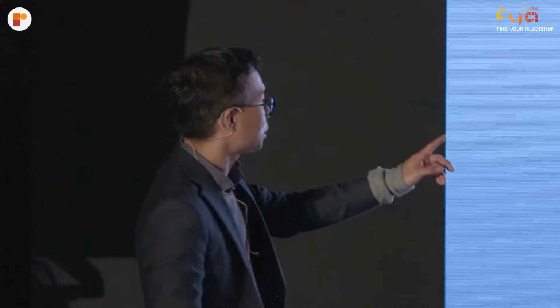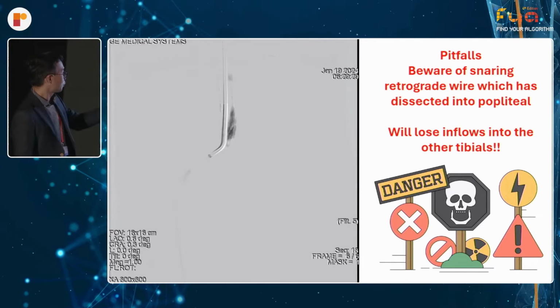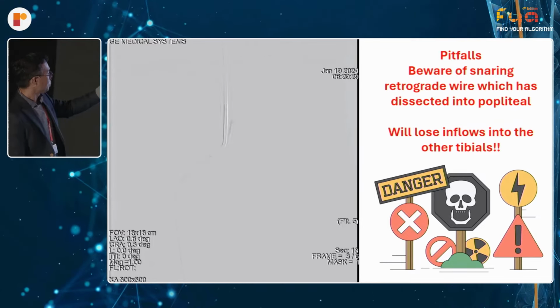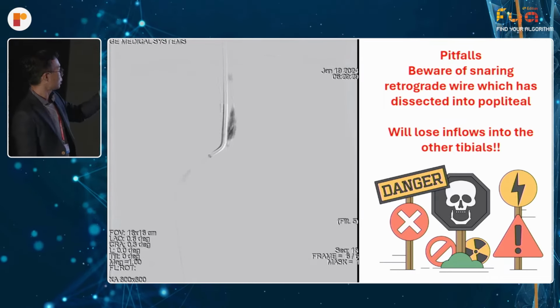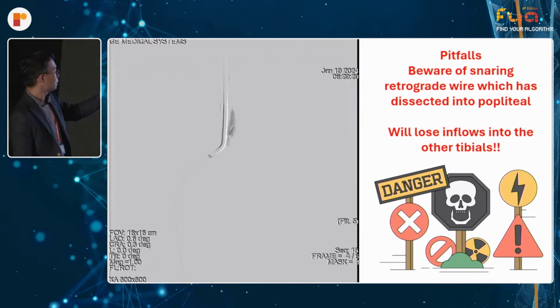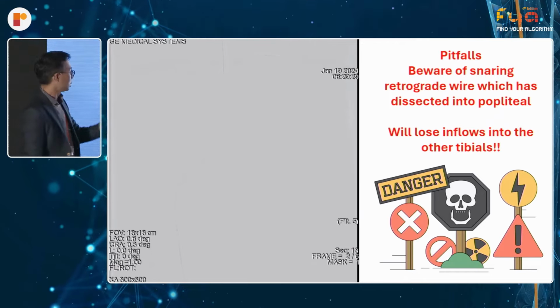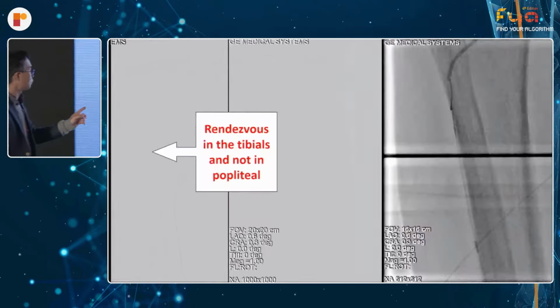So I just want to enter some pitfalls into the snaring portion of retrograde. For example, in this case, this is an occlusion of the anterior tibial artery, a small stump. The problem is, if you push your wire up into the popliteal and try to snare there, and this is a potential pitfall, your wire may be in the subintimal space in the dissection. I could potentially put my Bernstein catheter in there and snare there. But if you do that, in this case, you will lose inflow to all the other tibials. So really be careful about doing this.